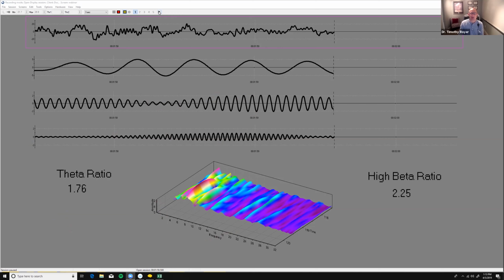So hopefully you understand that. You've got these different frequencies. They all do different things. We've talked about this the last couple of weeks. You've got your parasympathetic ones, which are deltas, thetas, alphas. They're responsible for resting. So disorders where somebody's more fatigued or having sleep problems or focusing issues that are related to slow waves, we're going to want to be looking at those delta, thetas, and alphas. And then you've got your perfect set of brain waves where the cycling is just exactly fuel efficient for the brain.